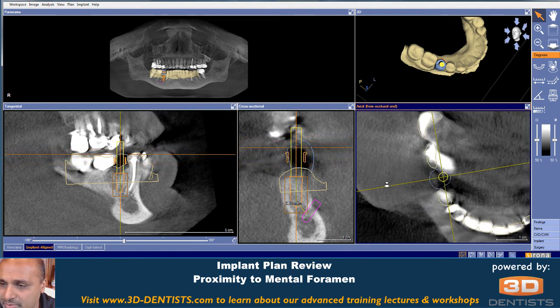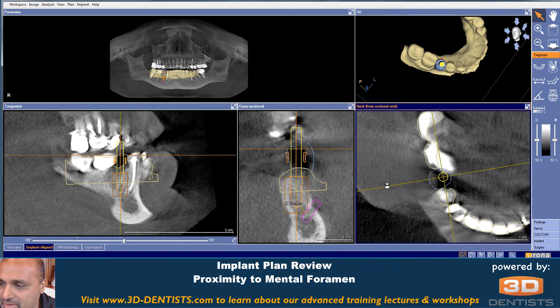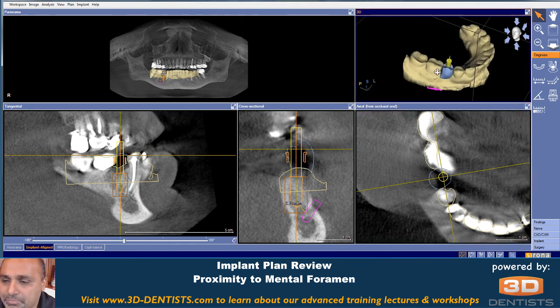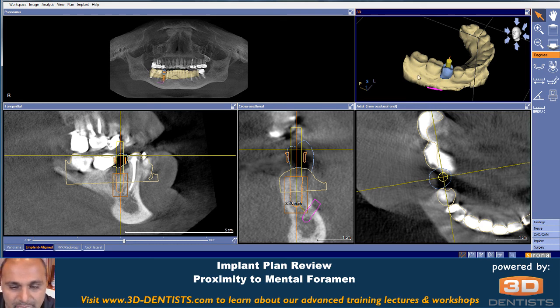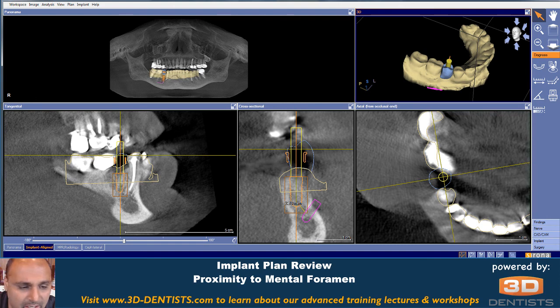Just a few minor things and food for thought in terms of placement. Not that the case can't be done or shouldn't be done, just some of the things that I'm looking at when we have this type of technology. I want to thank you, and hopefully you found this implant plan review helpful.